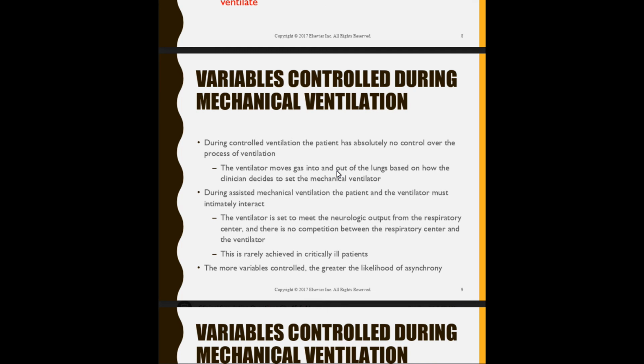So what we try to do is mimic the patient's breathing pattern and neurological output to stimulate, or should I say innervate, the diaphragm. So however long it takes, that's what we try to mimic.